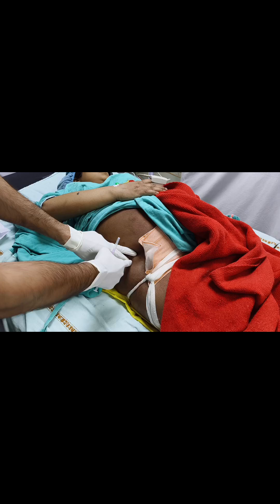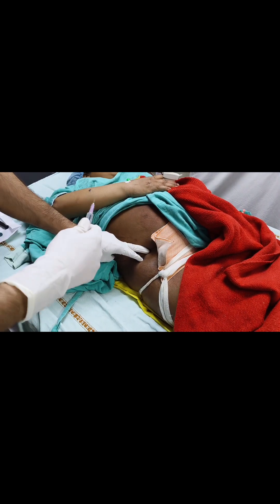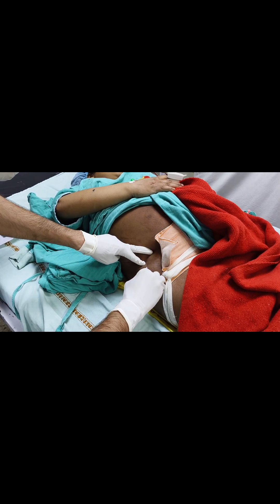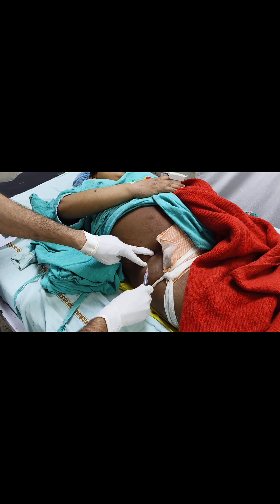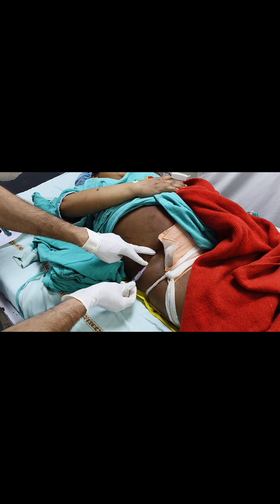This point will be the insertion point. Because the patient's spinal anesthesia has receded, it will give local in this case. So this will subcutaneously go like this. Aspirate. This is only in the subcutaneous floor.